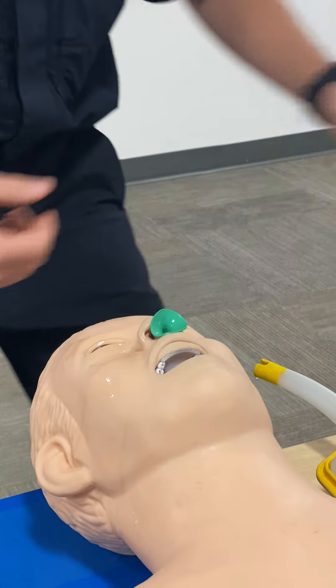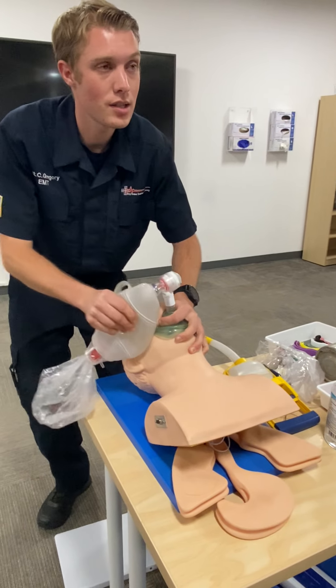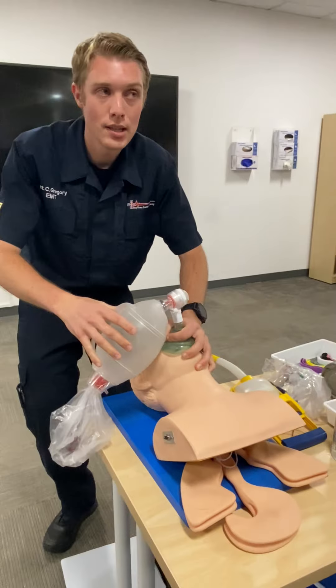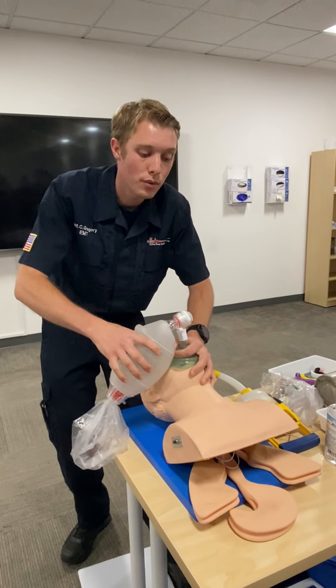Open, clear, maintained. Are they breathing? No. So I'm going to grab the BVM, hold the head-tilt chin-lift. For this adult, we give one breath every six seconds. For a child or infant, one breath every two to three seconds.